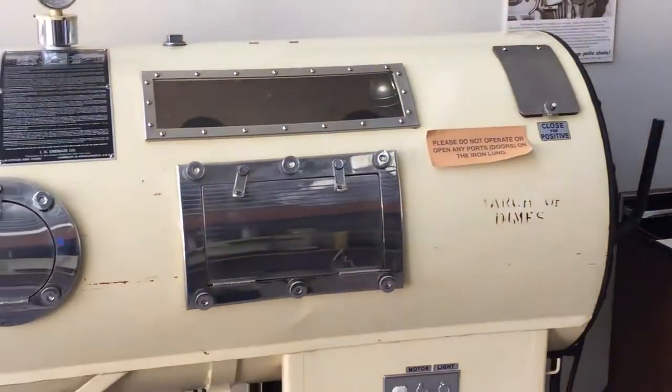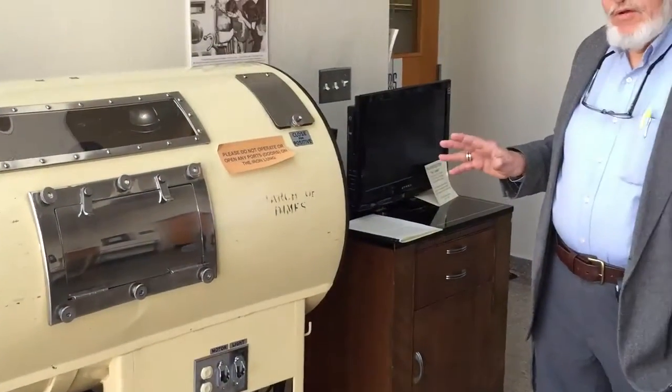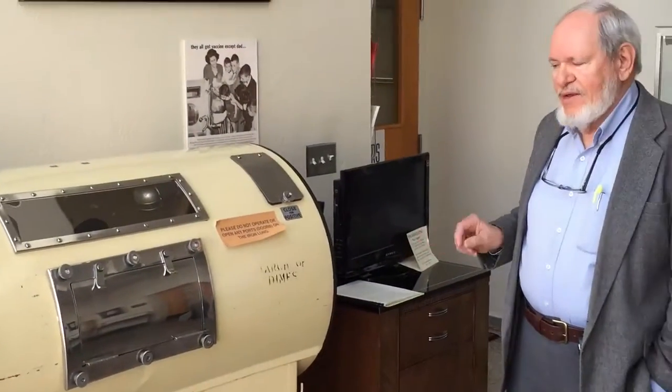The iron lung was a unit that was used to provide breathing capabilities for people, particularly those affected with polio.